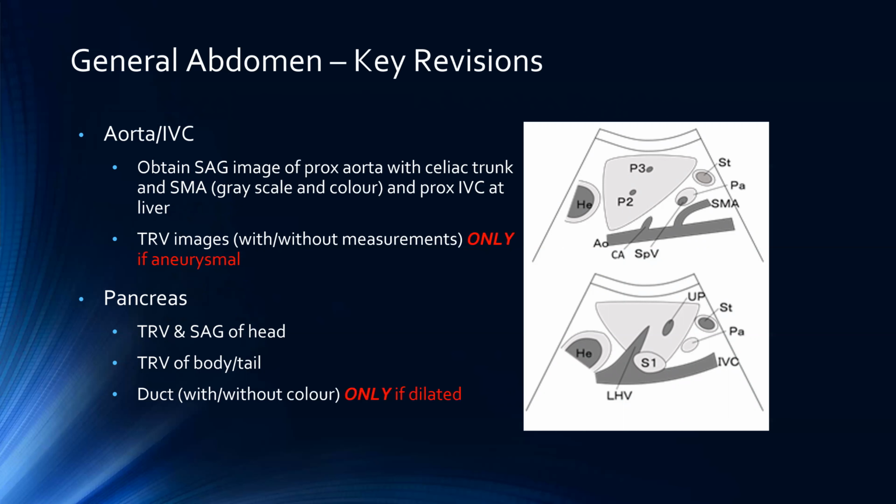I think it should also be said that not every patient is going to be the ideal textbook patient. I completely recognize that. From a visibility standpoint, I would say most of our patients are in fact far from this. But I hope by utilizing some of the imaging optimization techniques that are laid out in these protocols, and that we'll discuss, that we can ensure that at least within the limits of the factors that are in our control, the quality of the product that we're putting out from the ultrasound department is not just good, but truly exceptional. So without further ado, let's get started with our general body protocol.